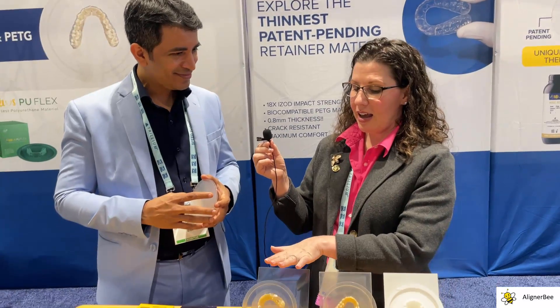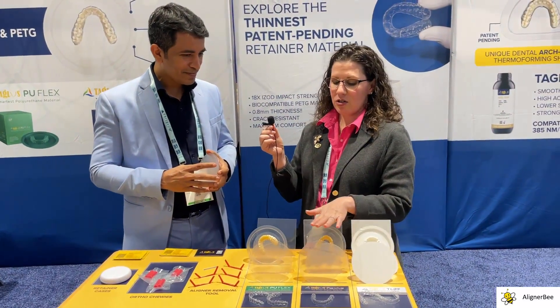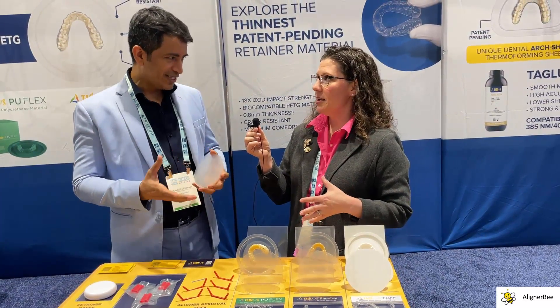So just to help everyone who's watching today, your new Taglist PU-Flex is polyurethane. Yes. And the traditional Taglist Premium materials — these are made with PETG. That's correct.